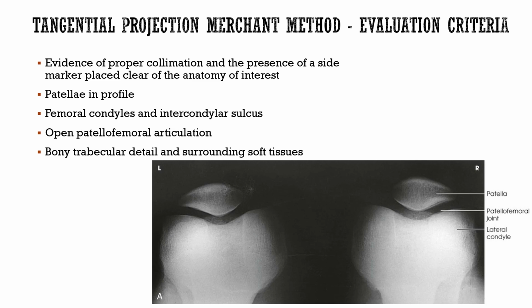And this is an image showing the patient in the Merchant method. We're going to see the patella in profile. We've got the femoral condyles, the intercondylar sulcus. The open patellofemoral articulations are important here too, and we can see the bony detail.